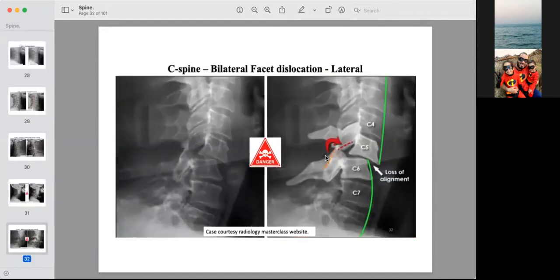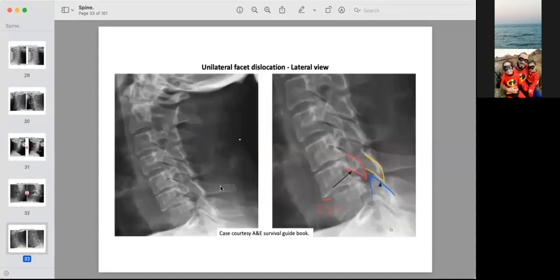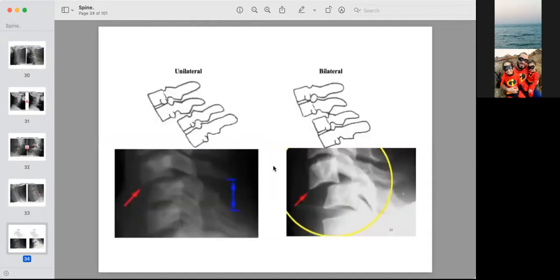Compare unilateral versus bilateral facet dislocation: in unilateral, there is mild alignment still in the facet joint and the displacement is small. In bilateral, the displacement is greater and both facets are interlocked. Always check facet joints carefully at every cervical level.